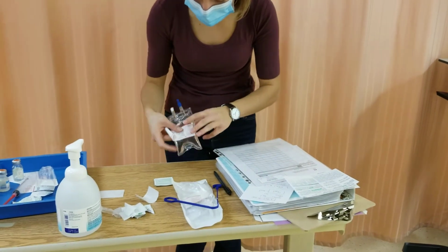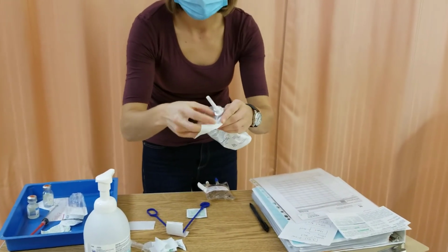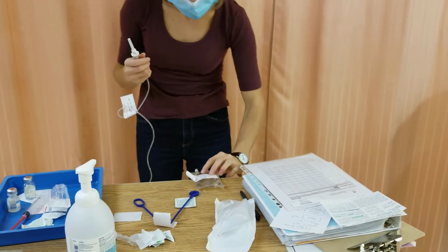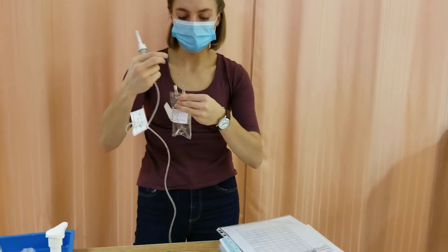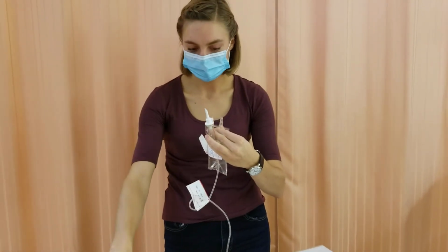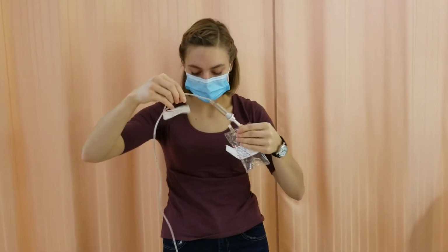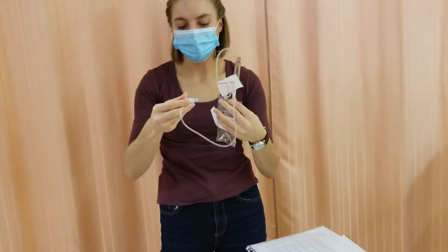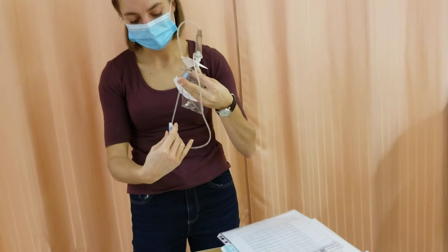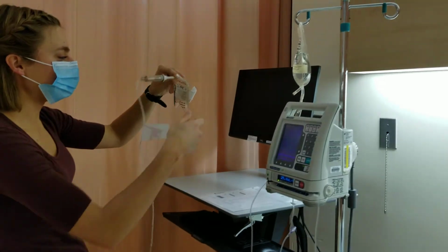So I can now attach my tubing. So to make sure I maintain sterile technique. Put that into there. And I'm going to make sure that my clamp is closed right now. And hang this up just for now.